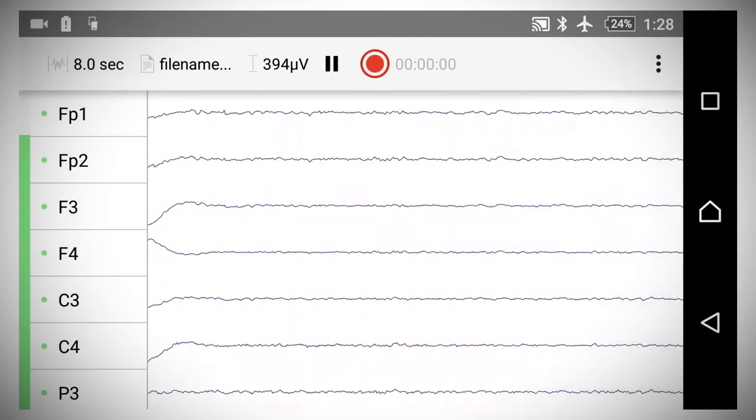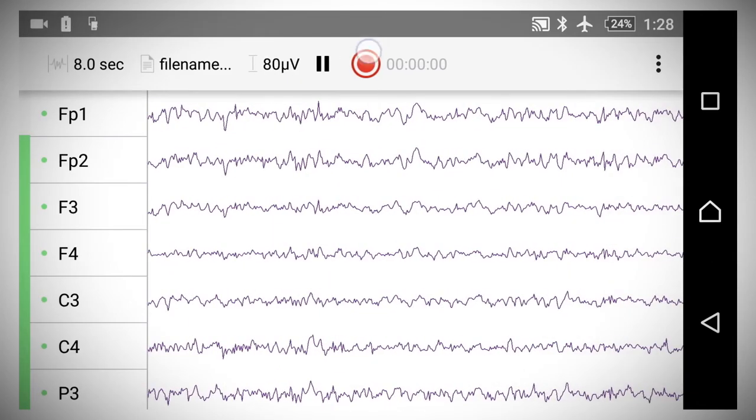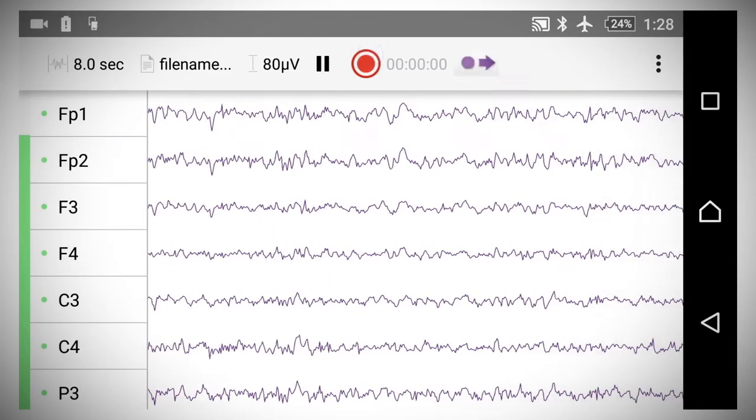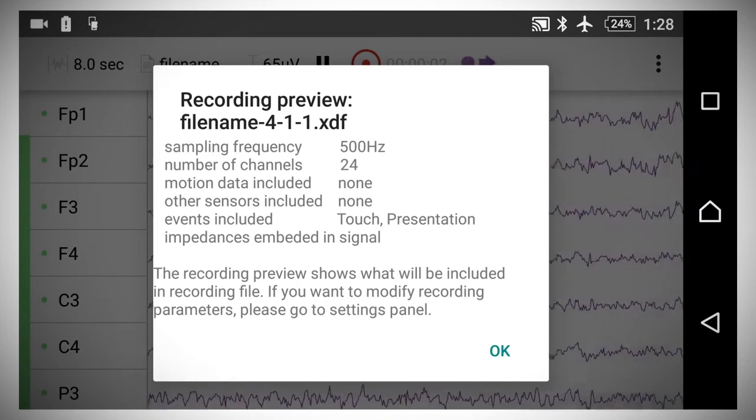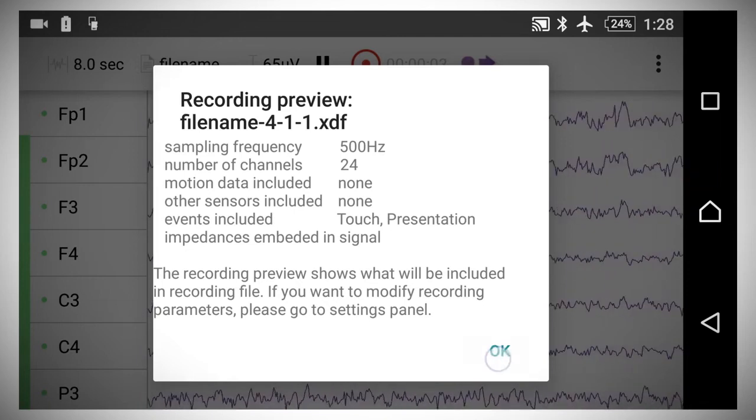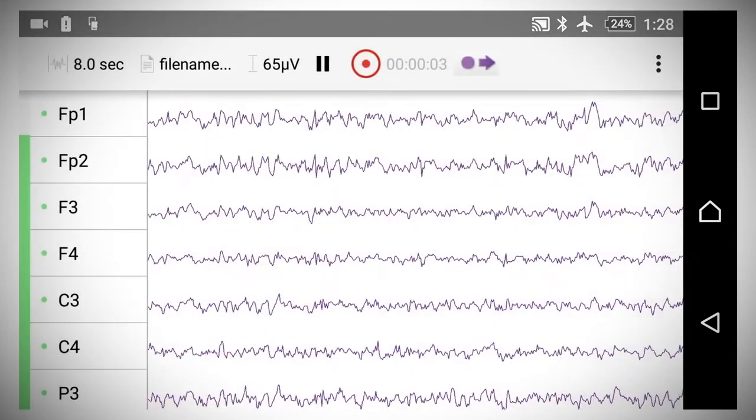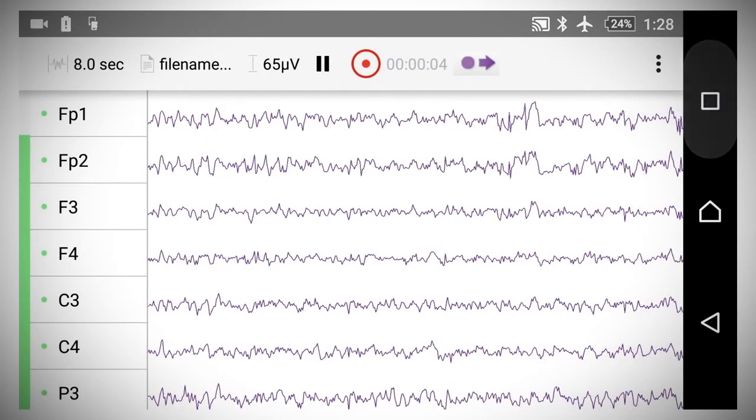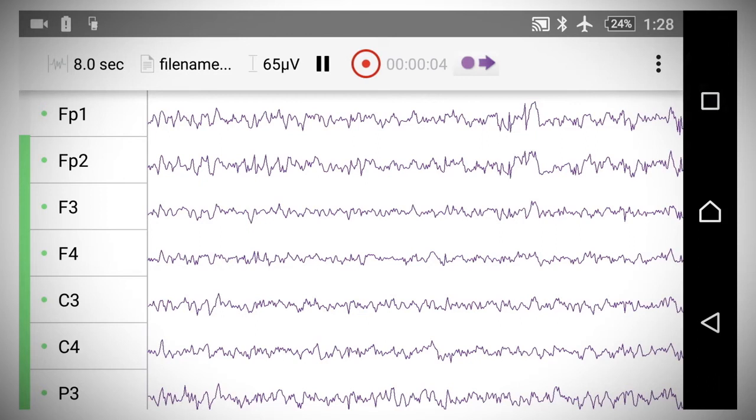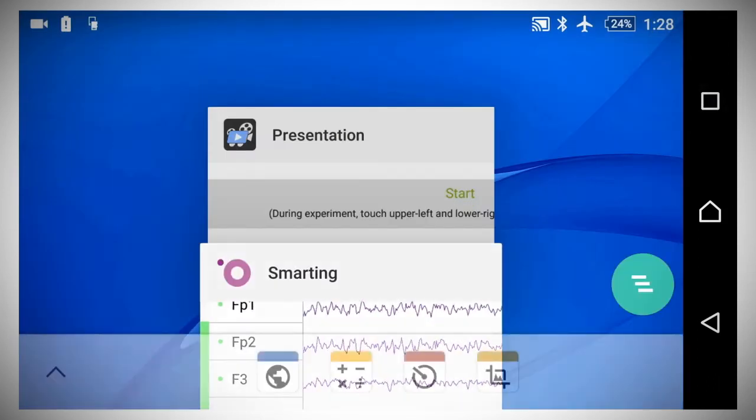Go to the signal show window, click record button and read carefully the recording preview. To start the experiment, press smartphone square button to return to presentation app.